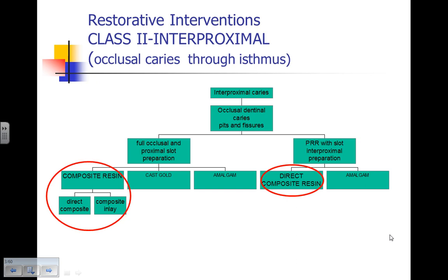One of the main rules that we try to abide by, besides good isolation with the dental dam, is if the gingival margin ends up being at the level of the gingiva or below, then we must consider another restoration choice. We know that the gingival margin of a Class 2 is high risk, and that placing a direct placement composite with poor isolation, even with a matrix in place, is not going to be successful.